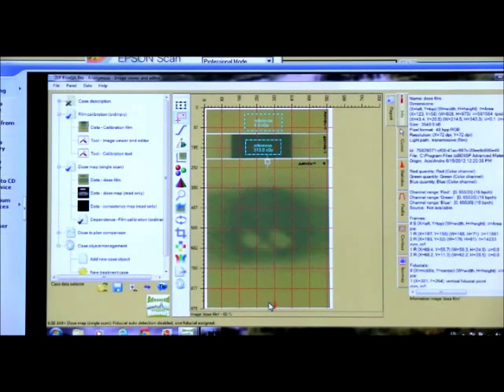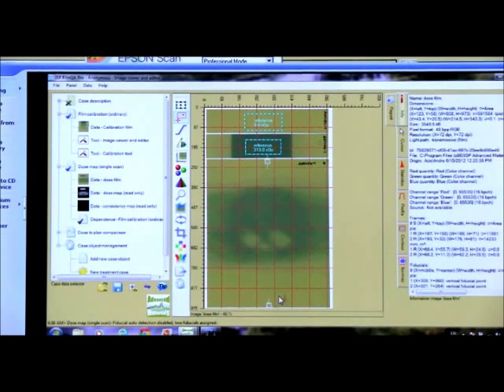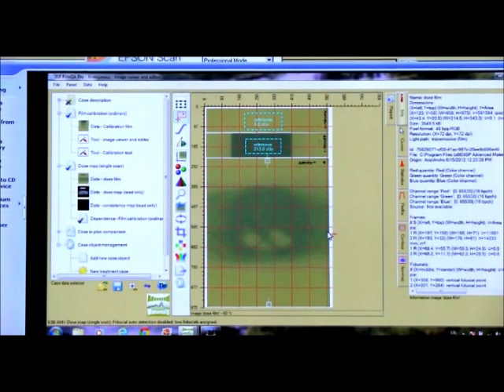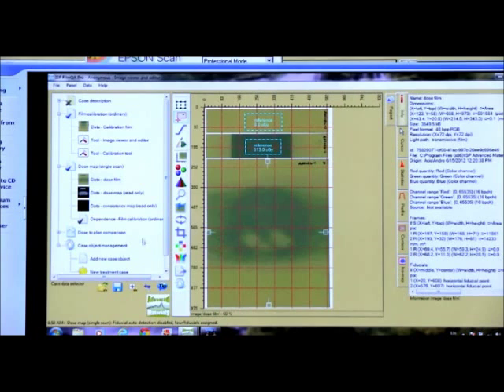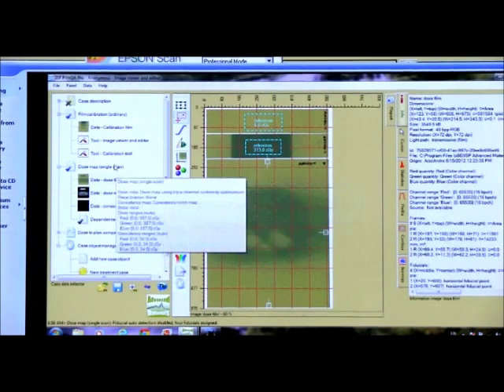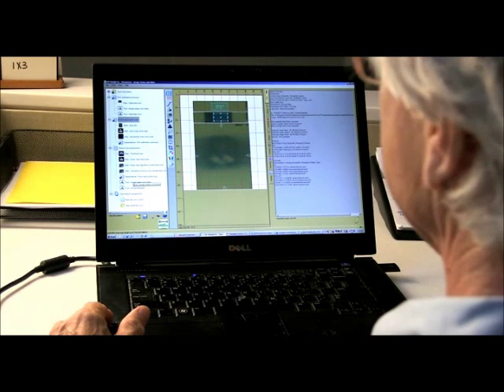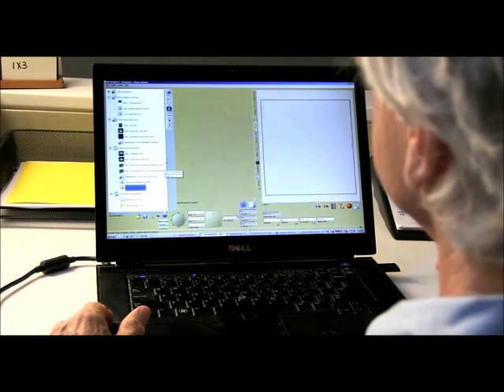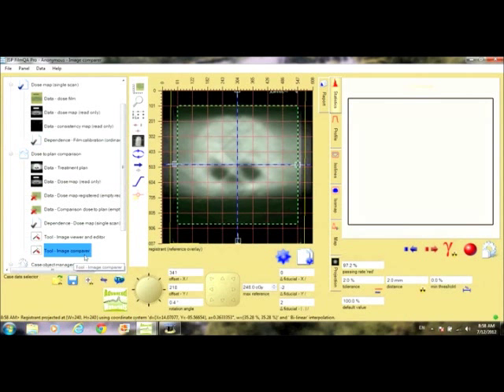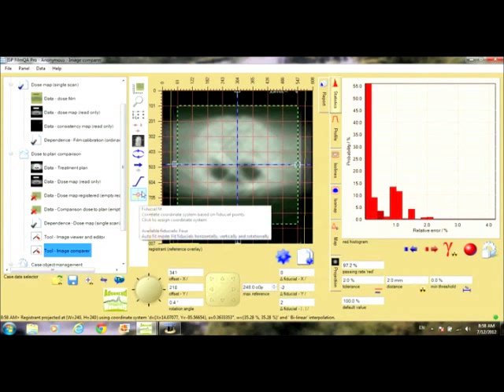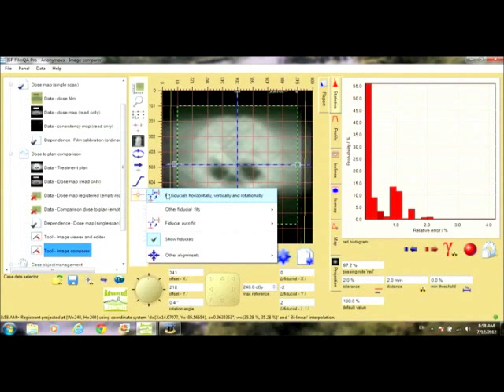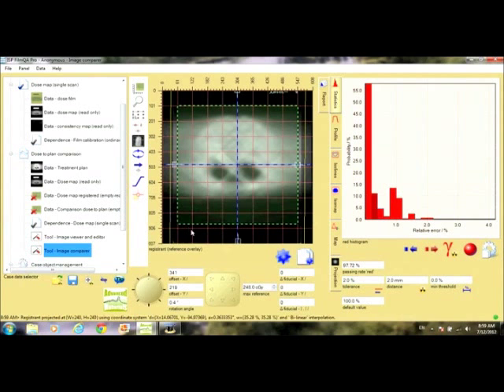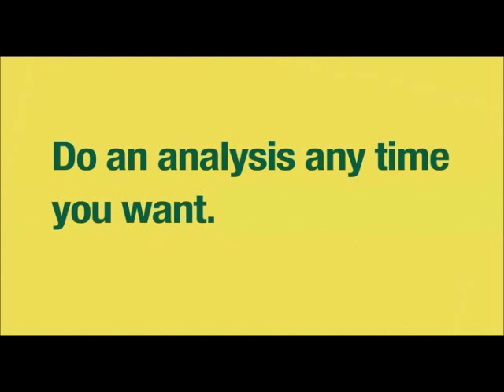Now, here's where you select the fiducial marks you placed on the film before exposure. When you start the calculations to recalibrate and compute your dose map, it will be ready for automatic alignment with the plan. Here's the dose map, and here's the plan, and here's the tool to register them. Now, you've got your answer in minutes. No waiting overnight for post-exposure changes to diminish. They no longer get between you and your results. And you can do an analysis any time you want, even at a moment's notice.